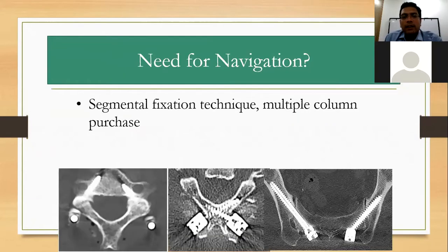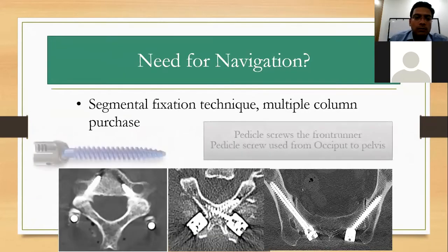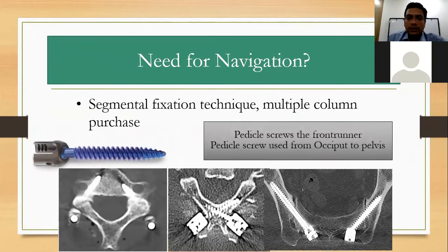So the need of navigation probably arose with the advent of the segmental fixation techniques. With the pedicle screw development, you have an option of having a multi-column purchase and segmental fixation. These pedicle screws help us fix or address pathologies all the way from the cervical spine to the sacroiliac joint.